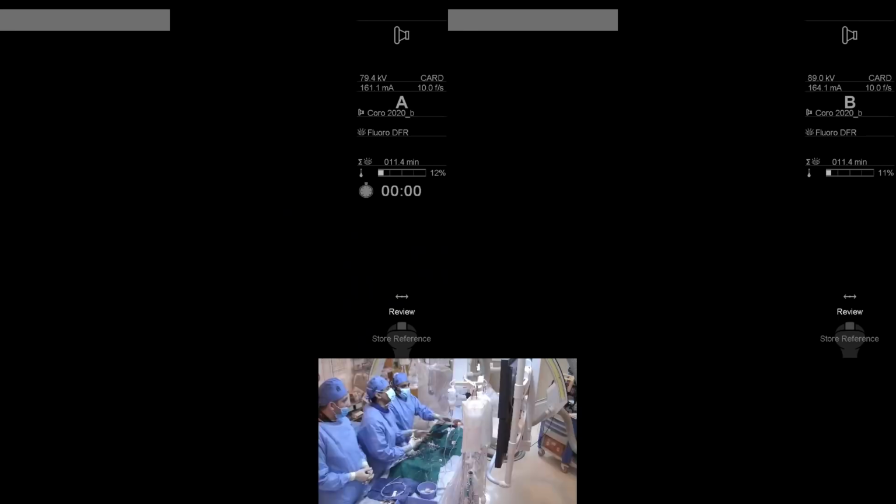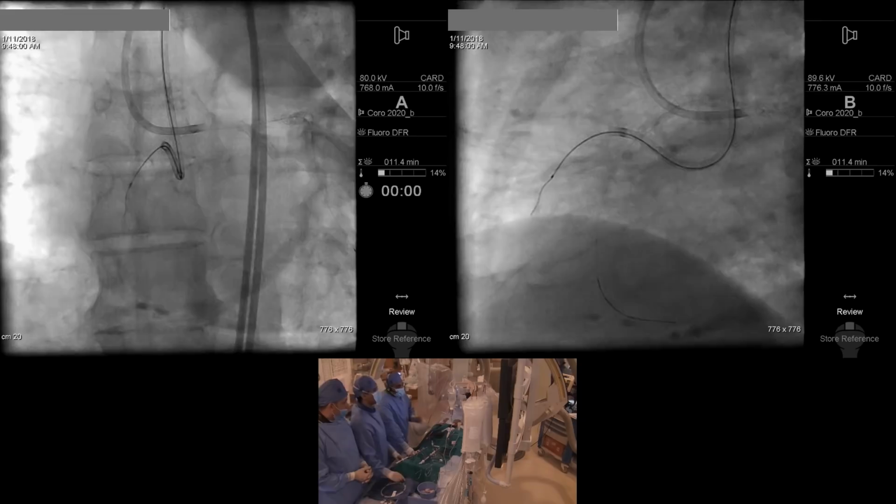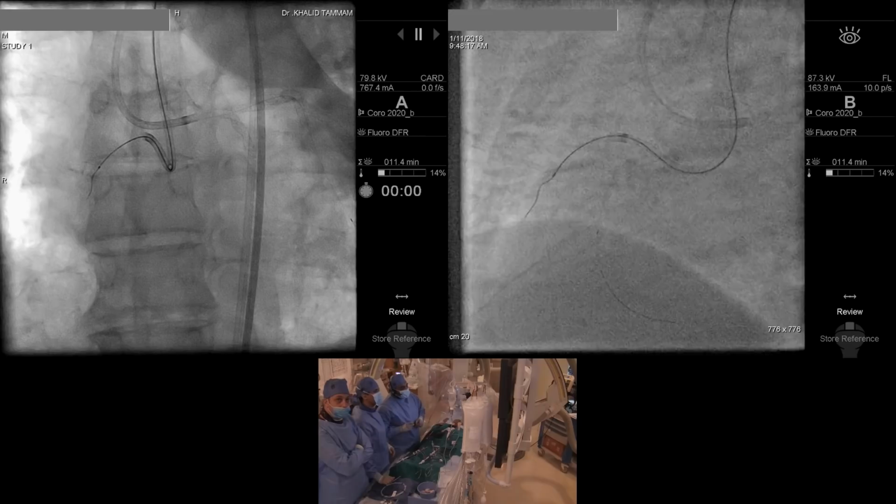Yeah, I will do X-ray without injection, please. Okay, yeah, injection. Yeah, nothing appears, but okay. Anyway, we can see that. I'm under the calcium, but the wire is going, so I don't know where it's going. If it's still an XTR, it's very likely that it doesn't cause much damage.